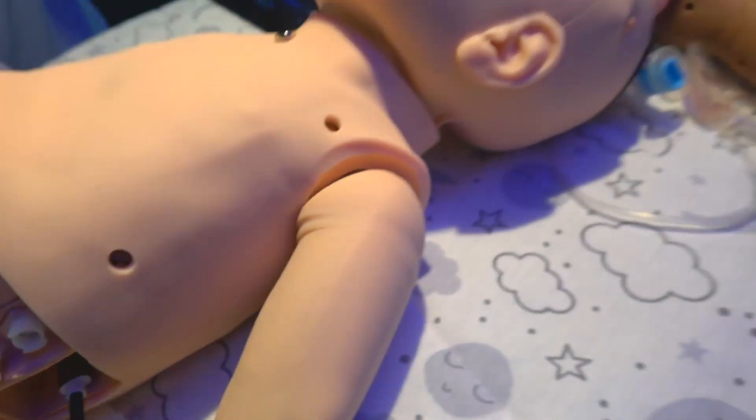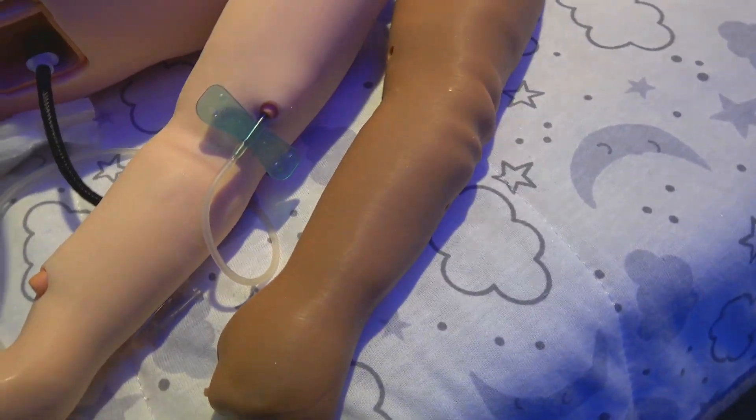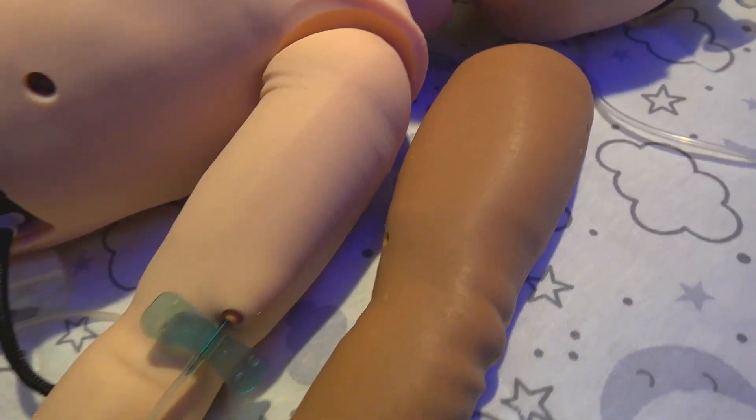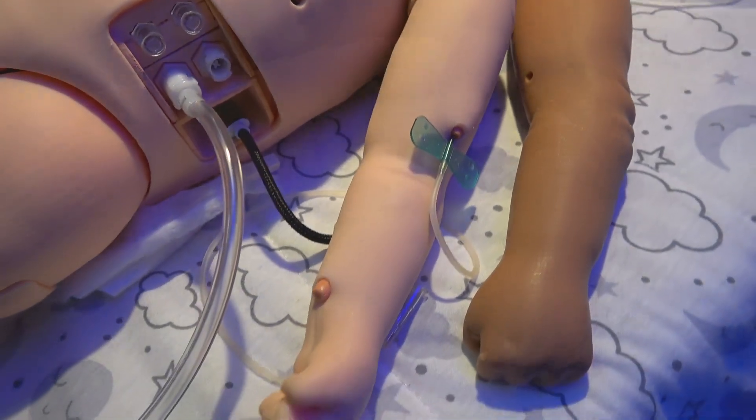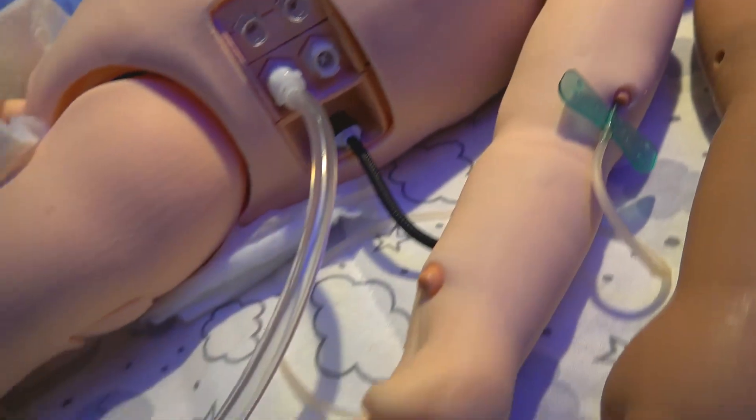We also have a second skin tone option — this will be a sample of our dark skin tone, as well as the medium or light skin tone that you see on Luna now. And Luna also has some arm movement to mimic seizure activity.